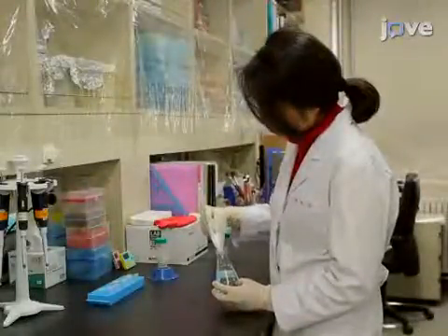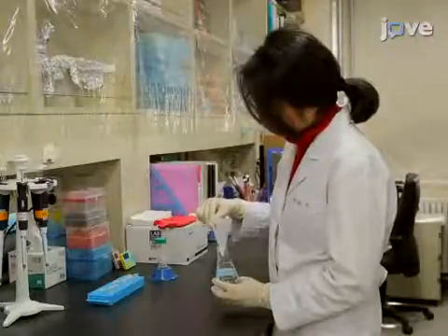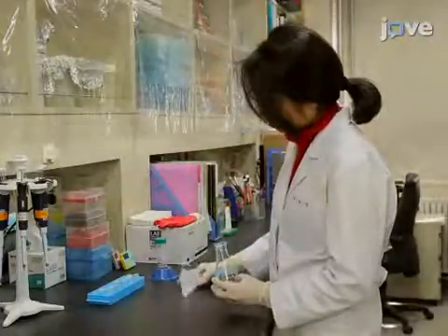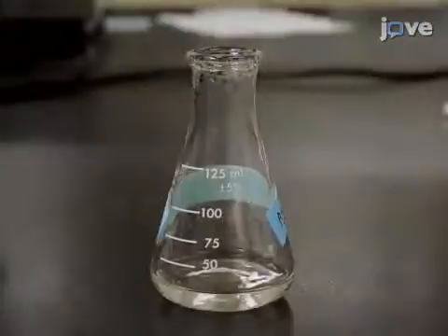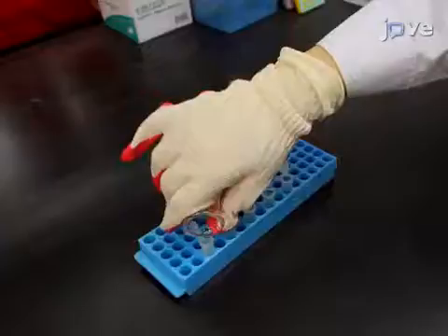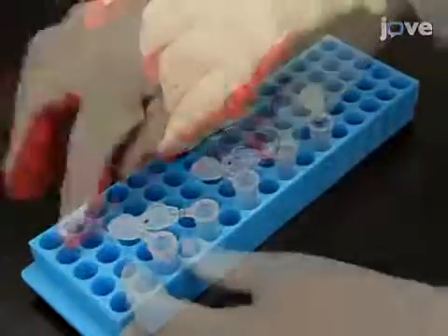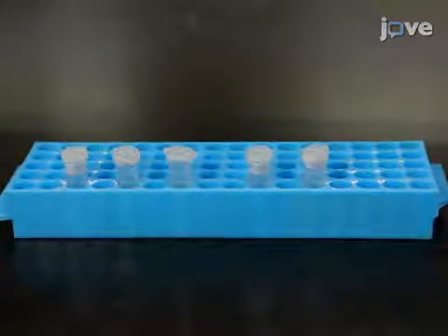To construct phantom acupoints, add 0.75 grams of agarose to 15 milliliters of distilled water and warm the solution in the microwave for 20 seconds until the agarose becomes transparent. While wearing gloves to avoid burns, divide the agarose gel into 2 milliliter aliquots in 5 tubes and seal them. Carefully position the tubes standing up straight and incubate at room temperature for 2 hours.